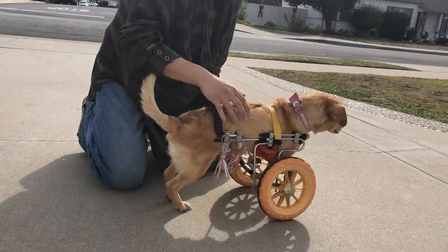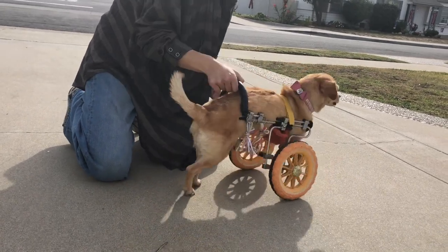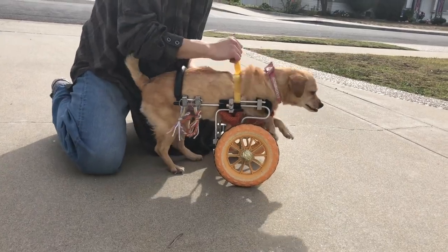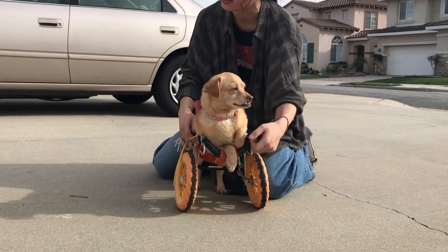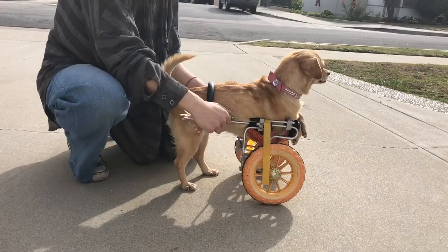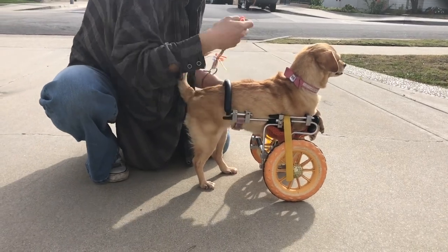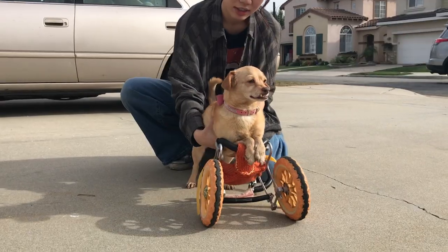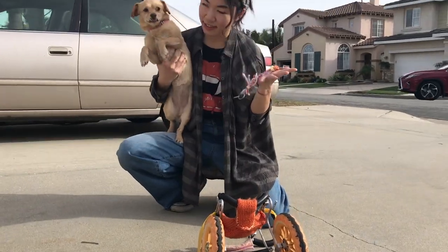Now, how to take her out of the wheelchair. She kind of cooperates with me, so I just reverse the steps. I take off the back straps and she'll go ahead and take out her body for me already. Take off the locks here, take off the back, grab her, and that's it. So it's pretty easy.